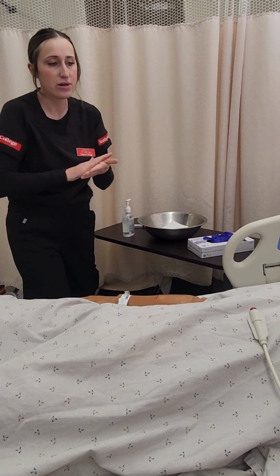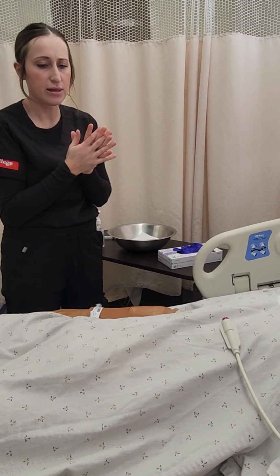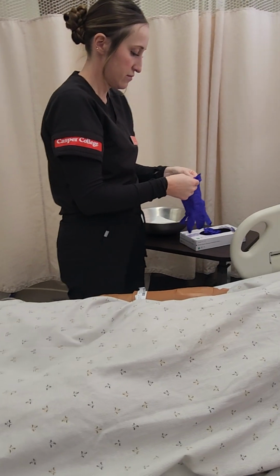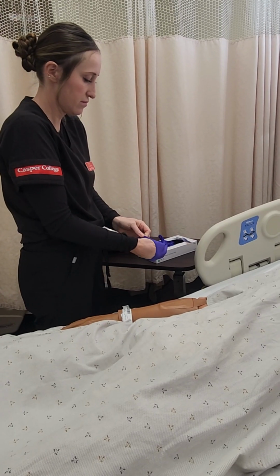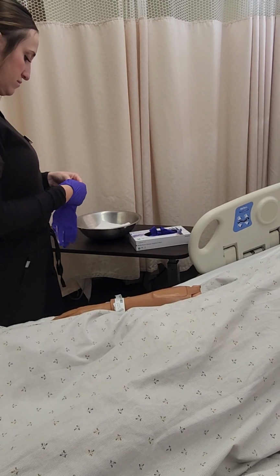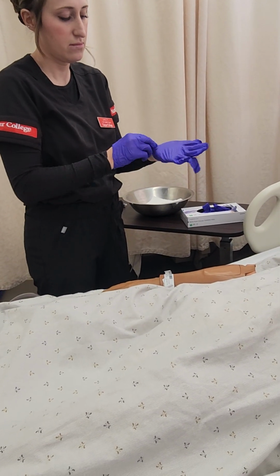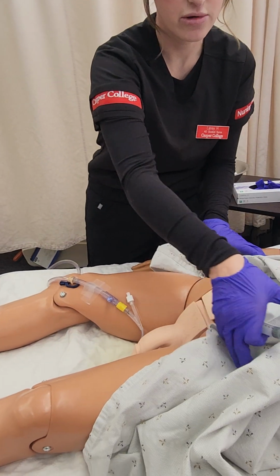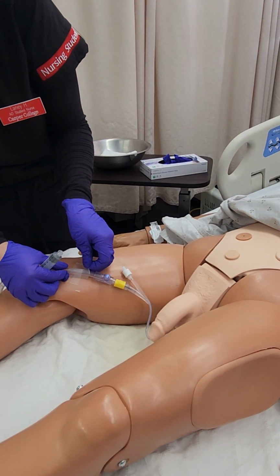Okay, so when I take this out, it should be relatively painless. I'm just going to have you take a deep breath, and on exhale, I will remove your catheter, okay? Okay. And I need my syringe to deflate the bulb. I'm just going to expose you a little bit. Okay. I'm going to remove the adhesive.